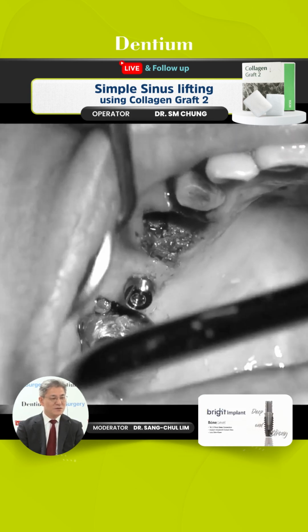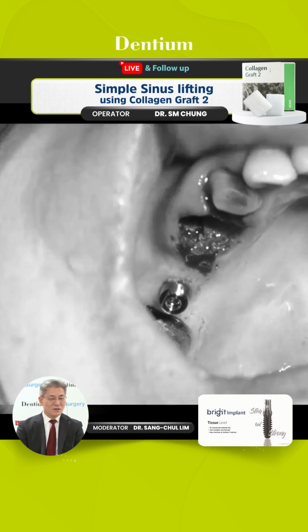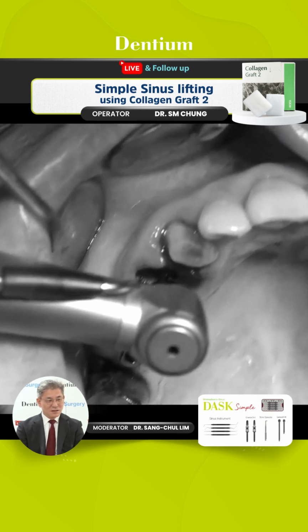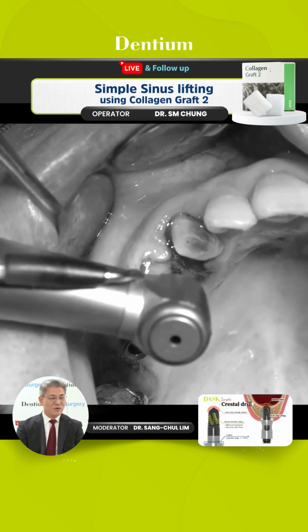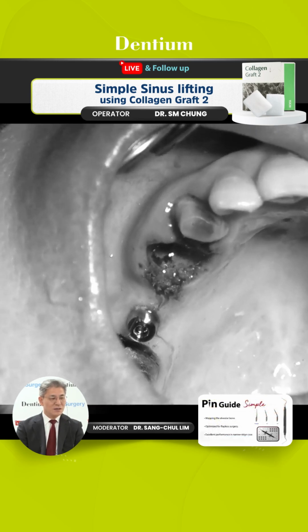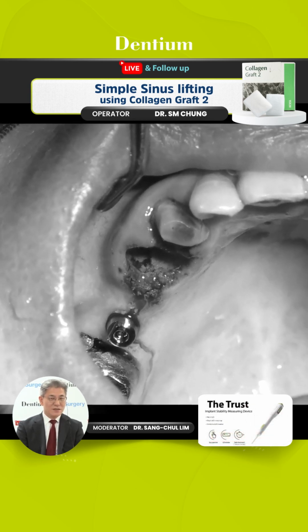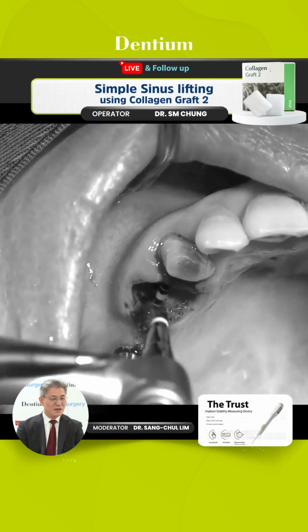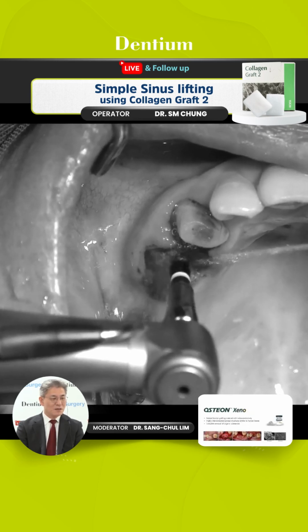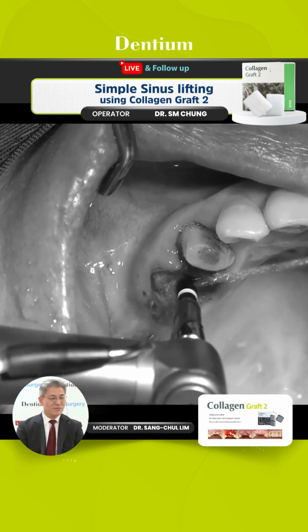Can you remember, first Lindemann, using Lindemann to take a point, the implant fixation site, and then directly convert to the compaction drill, and then more and more inserting and proceeding into the sinus area, sinus direction, and then finally grinding out the sinus floor is gone away, and then this autogenous bone pushing into the sinus cavities between intact membrane and sinus floor.